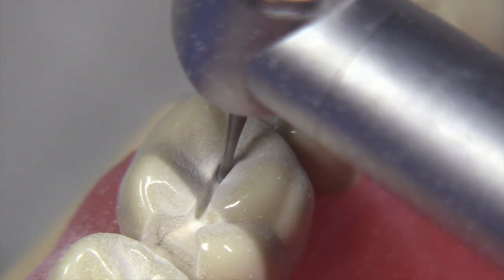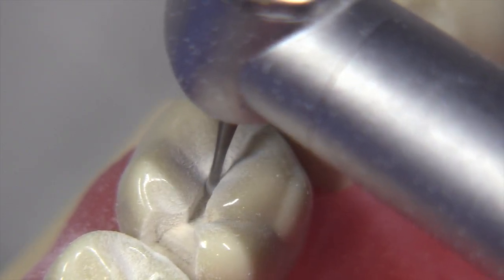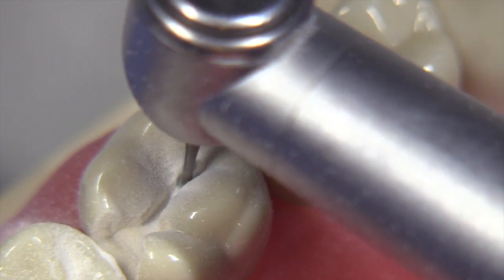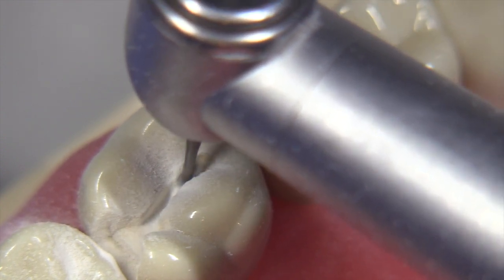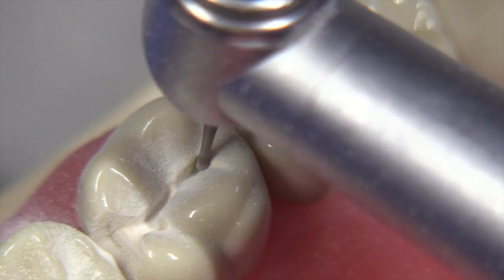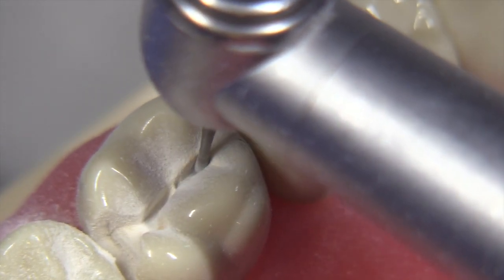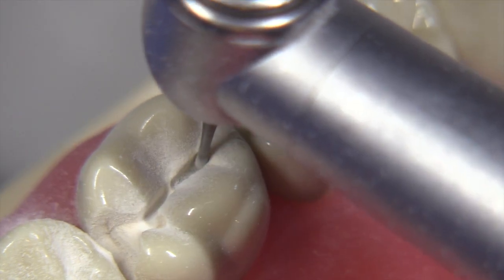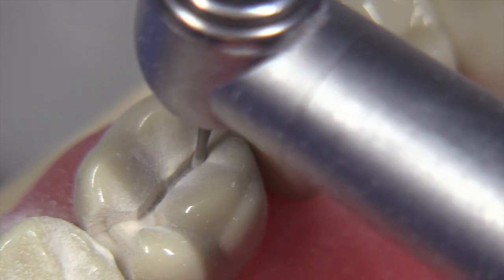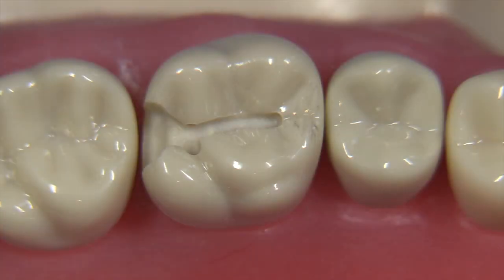We're working our way over towards the dovetail. The mesial dovetail location is going to be positioned such that you create a mesial wall located midway between the mesial pit and the height of the mesial marginal ridge. Of course, always have a little bit of divergence to that wall whenever you're up against a marginal ridge.